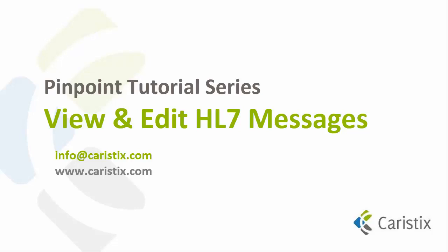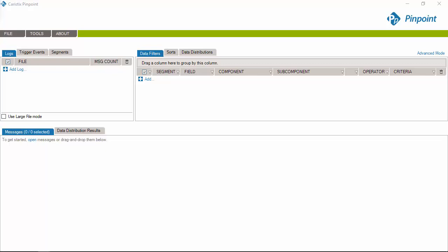Welcome to the View and Edit HL7 Messages tutorial for Caristix Pinpoint. First, let's open a few message files. Just drag and drop in the application.